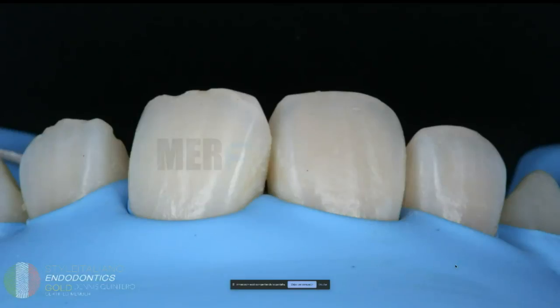I didn't use a clamp directly on the anterior tooth that has mobility, because I can do the extraction just by placing the anterior clamp. So that's why I make a multiple isolation, to avoid placing a clamp directly on the tooth because of the mobility.